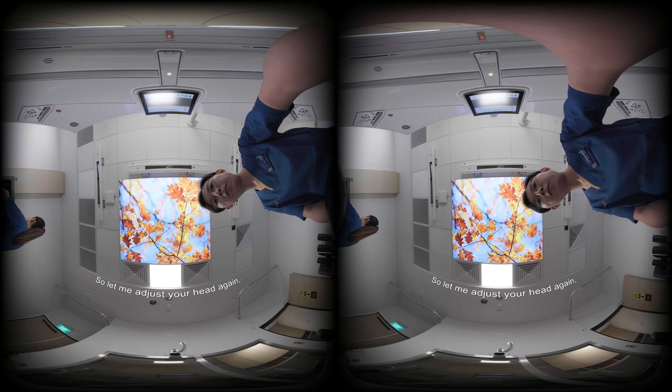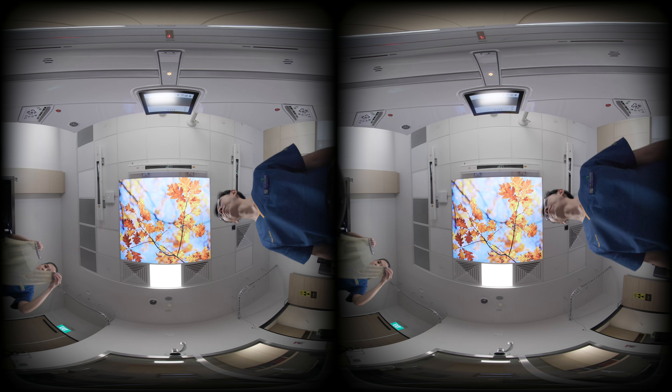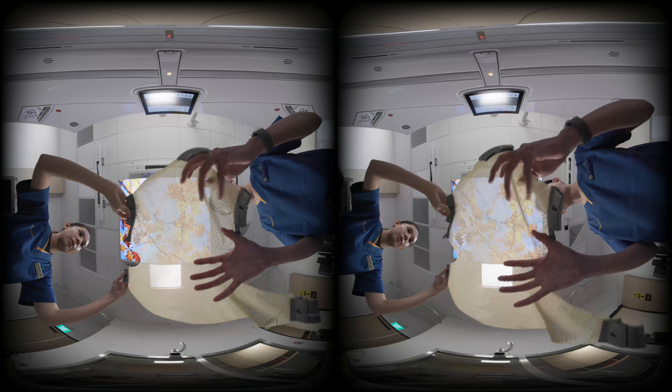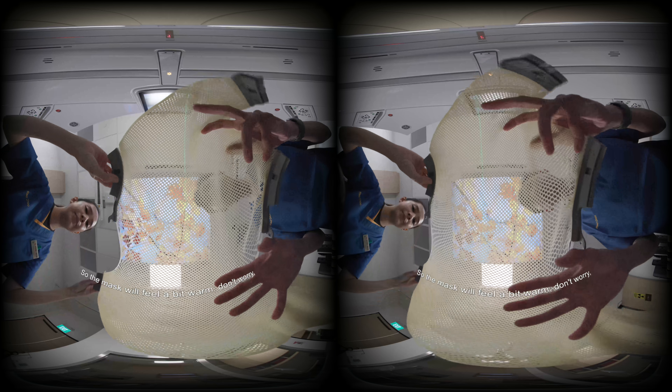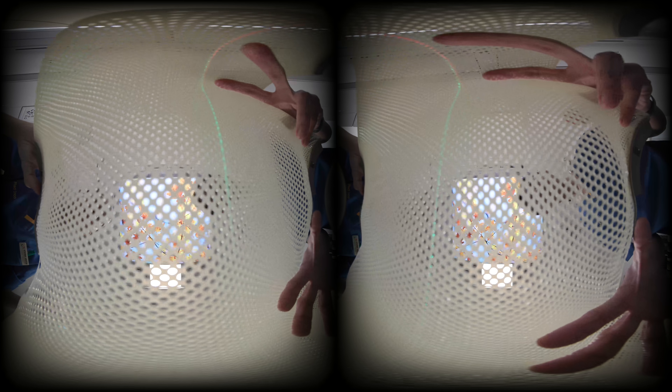Let me adjust your head again — I'll make sure you're in the correct position. So the mask will feel a bit warm. Don't worry, you can breathe as per normal. We're going to slowly put it on your face. You can close your eyes. Doing very well. We're all done with the mask making. We'll be removing it now. Just lie still. You're doing very well.